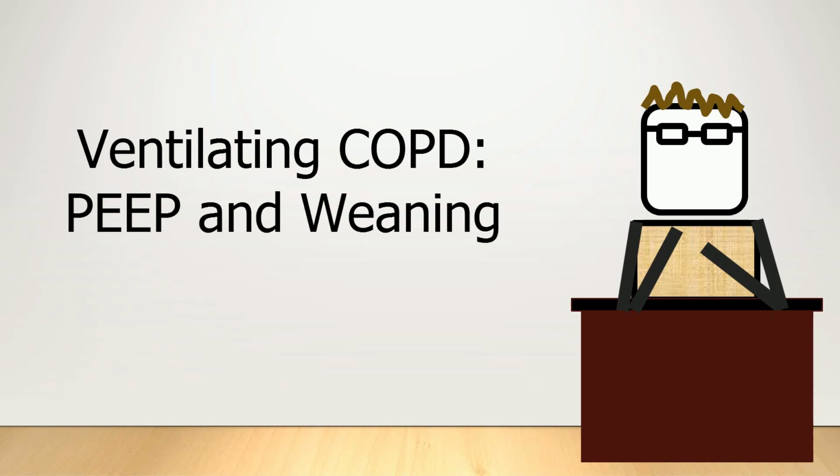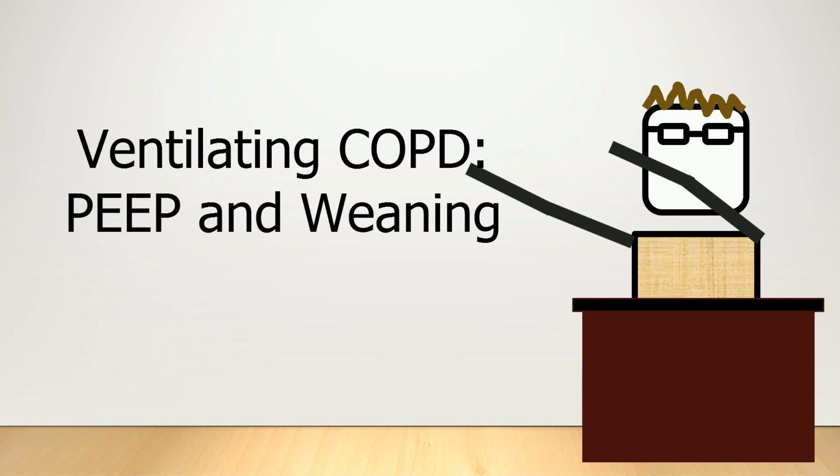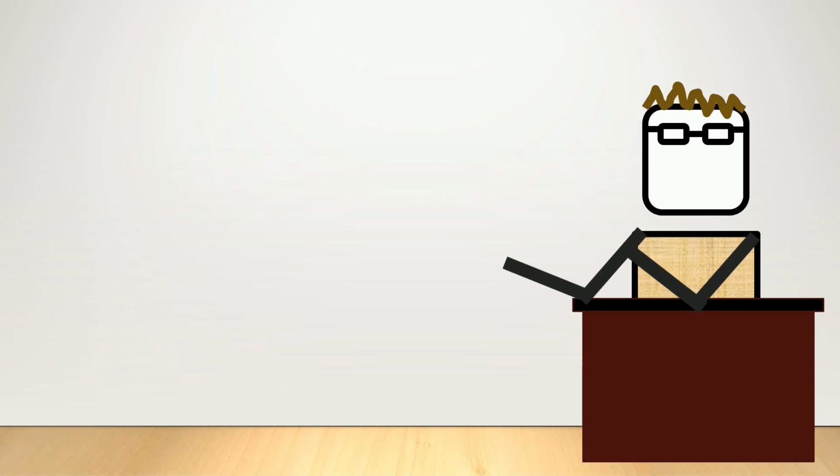Welcome to a basic introduction to mechanical ventilation. This is chapter 7.3, PEEP and weaning for COPD.